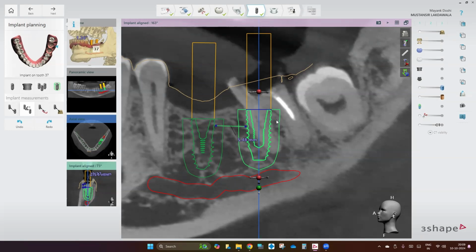They shouldn't be torquing the implant a single turn. I am guilty of this thing, doing it for over 50 implants.